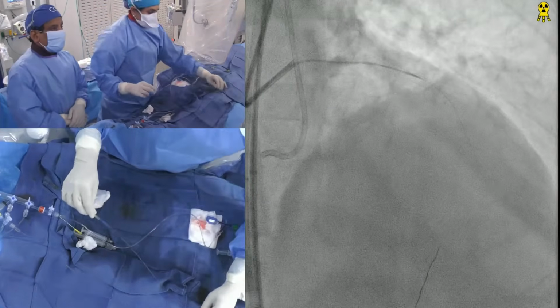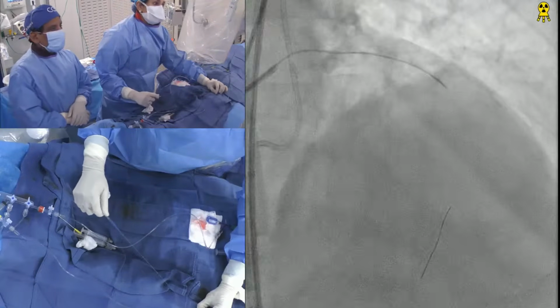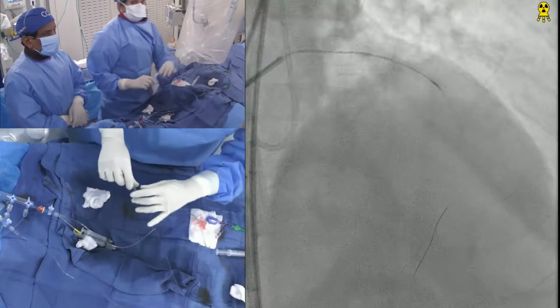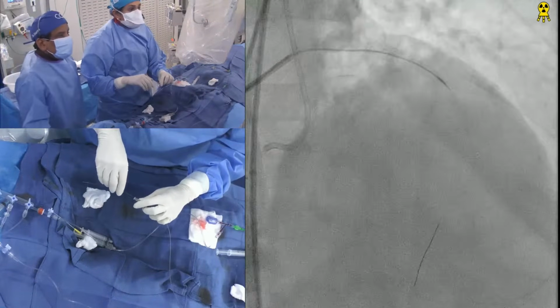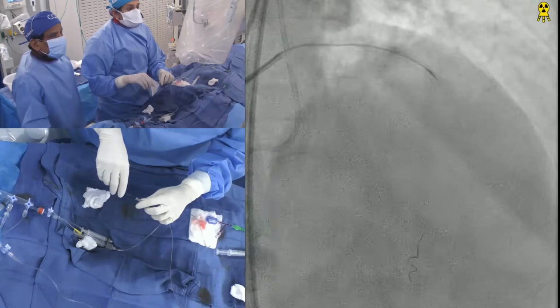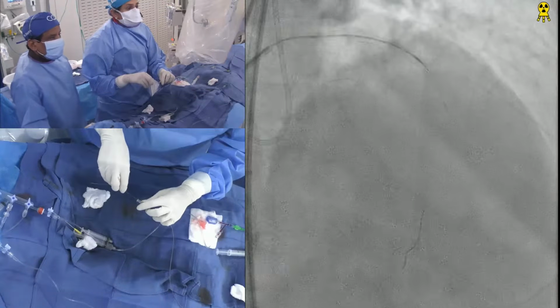See, this perforation can give rise to hematoma, and though it's just septal, we have had cases of tamponade. What is that? Want to be aggressive here? I don't want to be aggressive. Let's try the first septal itself.